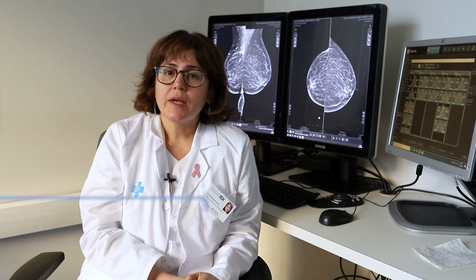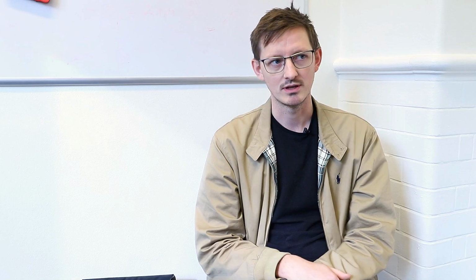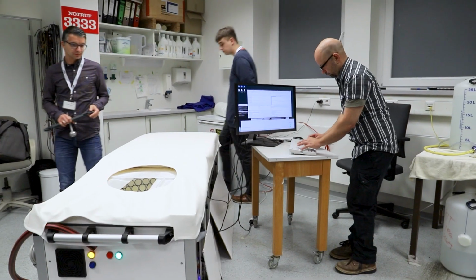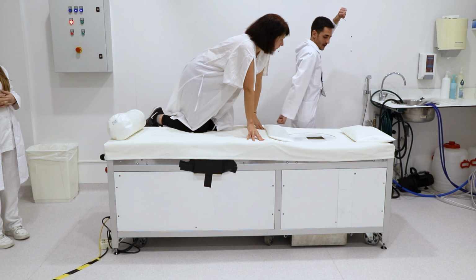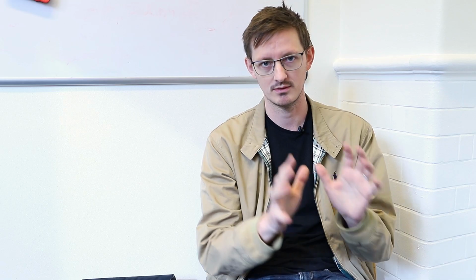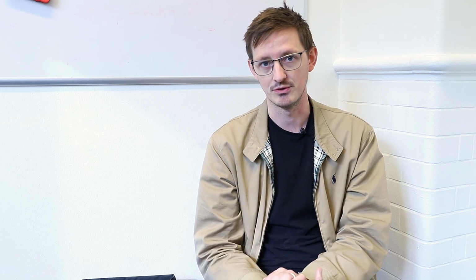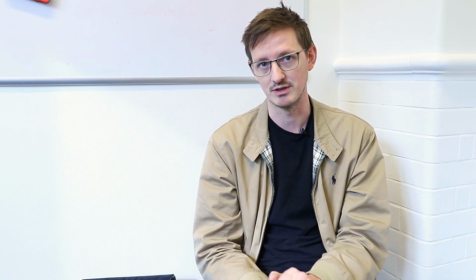we want. Well, the benefit for the patients using the new diagnostic tool is mainly to avoid the radiation dose. The QUSTom project is really split into 3 parts. So there's the device that we do the imaging with, there's the software that we do the reconstruction with, and then there's the 3rd part of the project, which is how we evaluate the quality of these images.